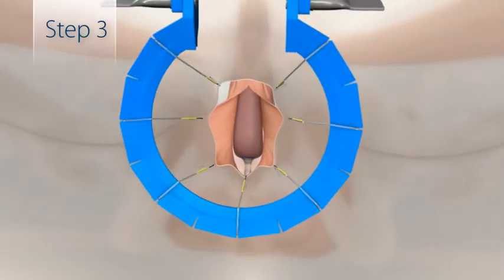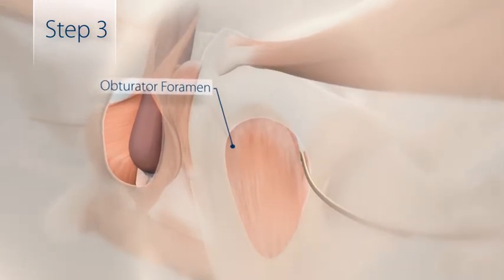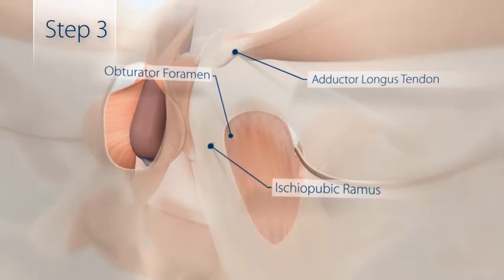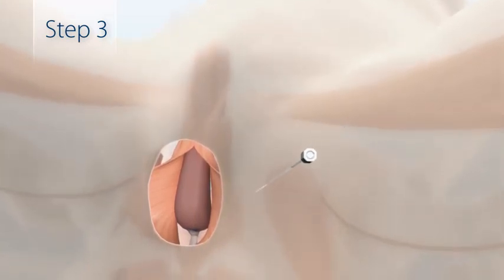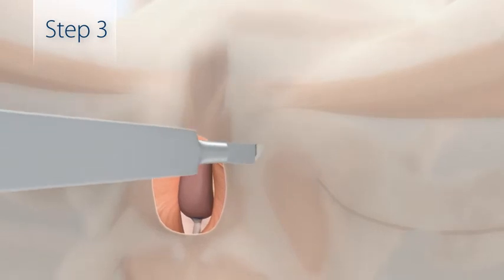The AdVance helical needle passer will be inserted into the obturator foramen, about 1 finger breadth below the adductor longus tendon, just lateral to the ischial pubic ramus. To identify the proper insertion site, palpate the inferior pubic ramus and feel for the bony landmarks. Make a small stab incision at each needle entry point.